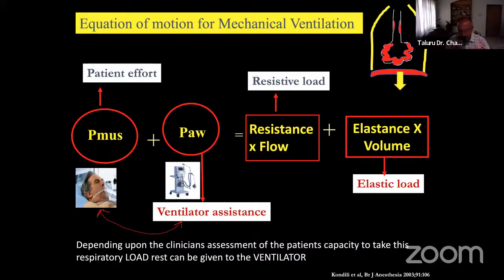So the judgment is always how you analyze the capacity of my patient to support, and the rest goes to the ventilator. So different modes can be applied, and it is not rocket science. It is very, very easy. In the next 1 hour, I will see to it that you understand what the modes are and their application, and how to introduce modes to the patient to the best of your capabilities. Three things have to be considered when a mode is chosen: safety, comfort, and weaning. Safety, comfort, and weaning.